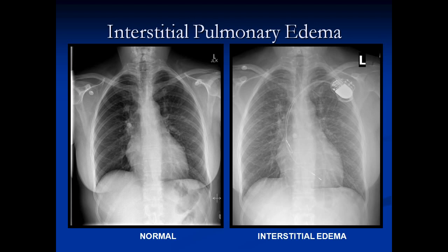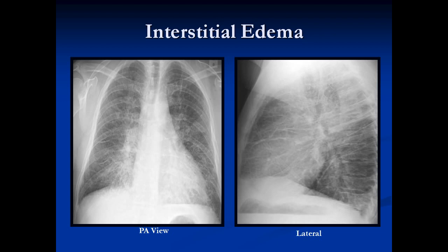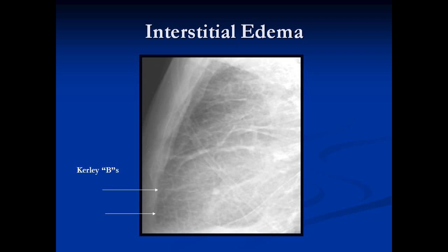This is the same patient — normal on the left, abnormal on the right with interstitial pulmonary edema: way more lines, ground glass haziness, hila are bigger, and the vessels are ill-defined. On the lateral view, there's thickening of the fissures, the hila look bigger and smudged, and sometimes there are small bilateral effusions. To summarize the changes of interstitial edema: peribronchial cuffing, Kerley B lines, thickening of the fissures, small bilateral effusions, increased interstitial markings, and hila enlarged and indistinct.